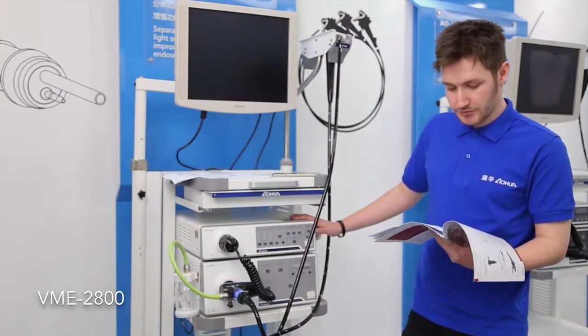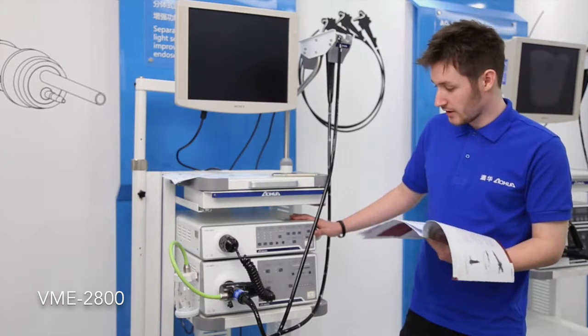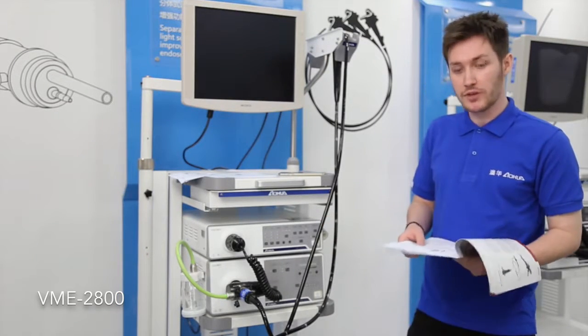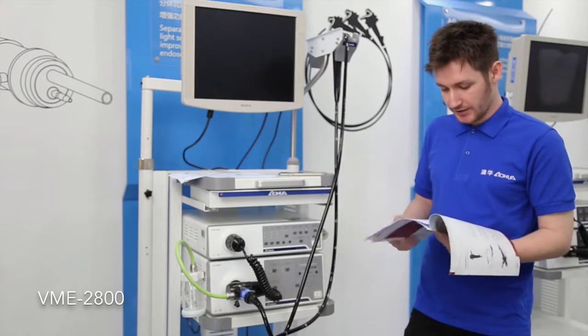This is the VME-2800, a mid-level system. Unlike the previous system, it has a split design for the light source and processor. We're offering three types of light source with this model: Halogen, LED, and Xenon.